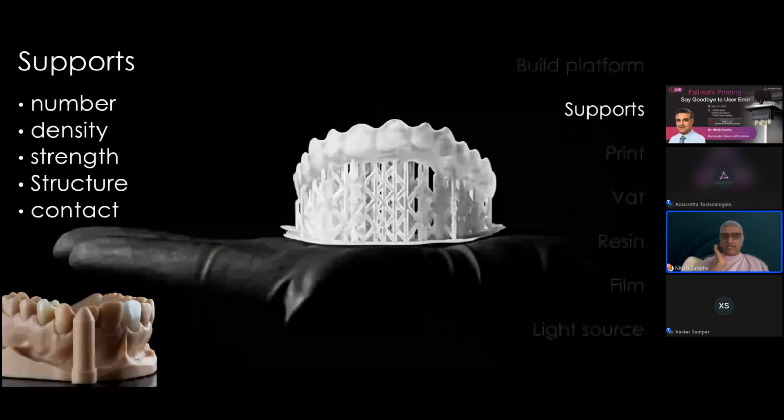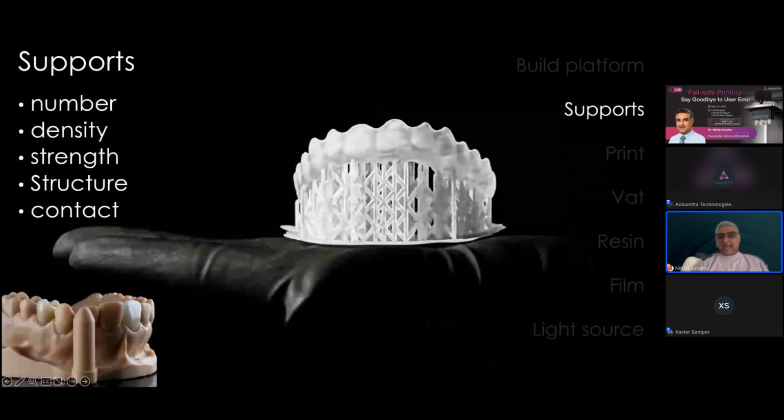Whereas if you have supports help you to actually define how much of a layer actually gets printed at one particular point in time. So if you've got a splint like this and you've got it angled at whatever degrees this particular splint is angled at, then to the horizontal, you can try and imagine what layers of this splint will be printed. First layer would be something in the molar region, and then after that is printed something in the premolars would print, and then slowly you would have smaller and smaller areas of layers of resin that actually need to peel away from the film, and supports enable that.